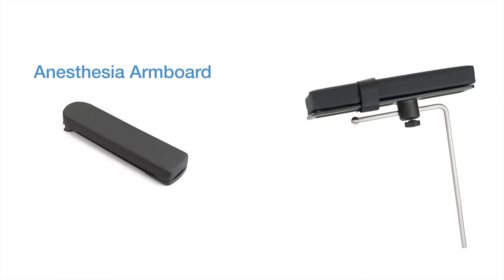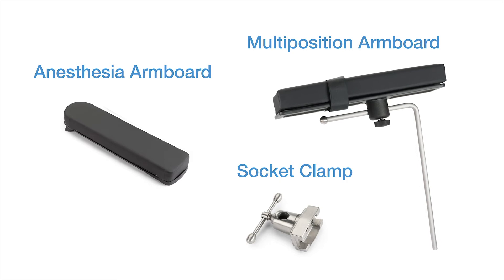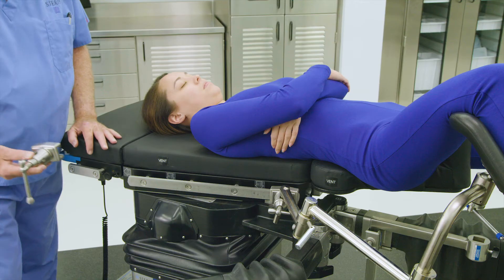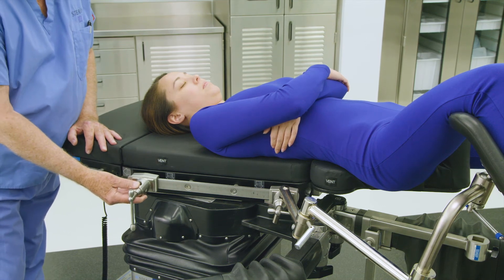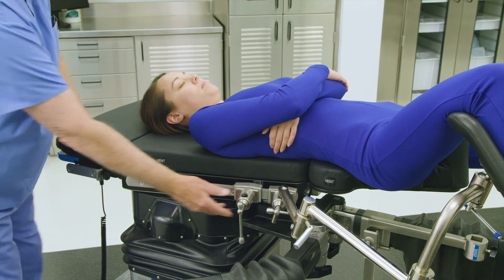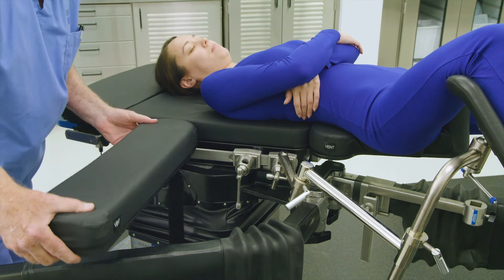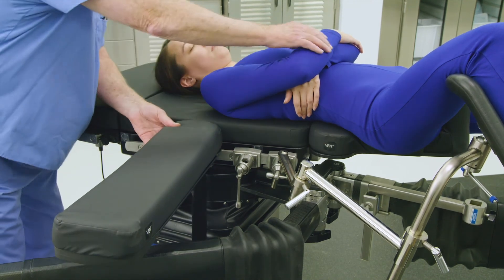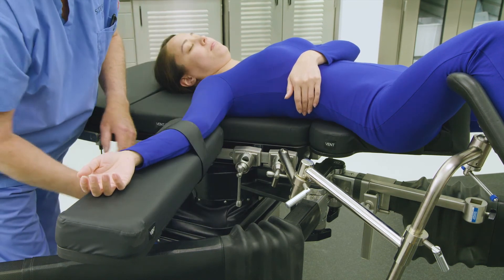The OT-1000 series table is equipped with both an anesthesia arm board to help position the arm on the non-operative side of the body and a multi-position arm board to help position the arm on the operative side of the body, to ensure patient arms are properly positioned during the procedure. Before attaching an anesthesia arm board, first apply a socket clamp to the side rail on the non-operative side of the table. Next, apply the standard anesthesia arm board to the side rail of the table on the non-operative side. Adjust as needed to accommodate proper arm position, and apply the safety strap to secure the arm.